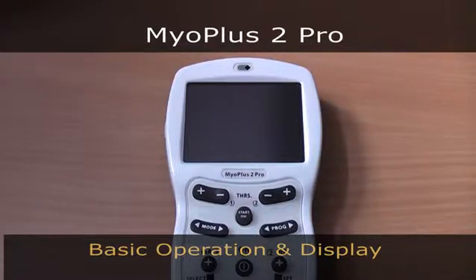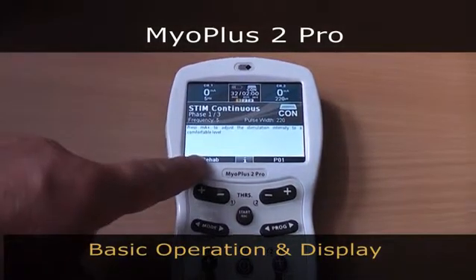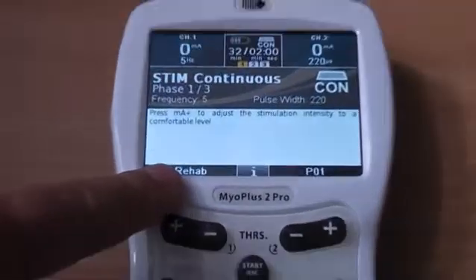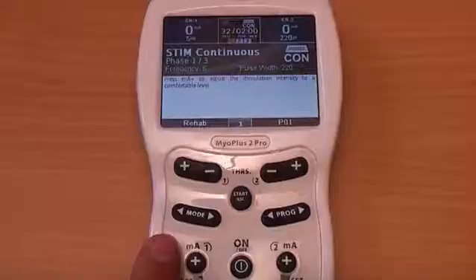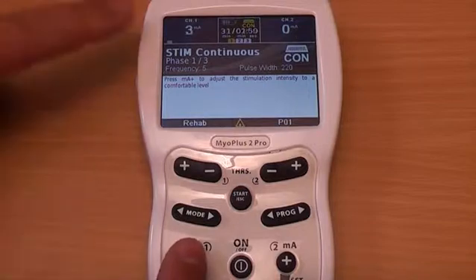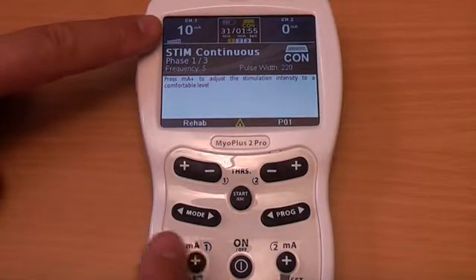In this video we will show you the basic operation of your Maya Plus Pro. When you power the unit on, the unit displays the last program used. You can start using it immediately simply by pressing the milliamp plus button in stimulation and ETS, or by pressing the start button for EMG mode.